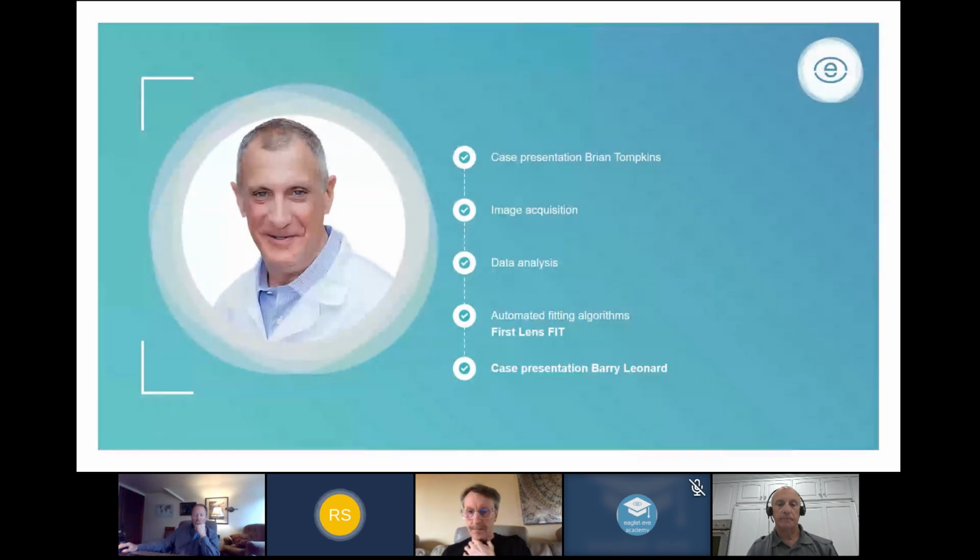There was one more question. Paul Kuzi asks, does it recommend the best overall diameter? No, it does not. You can do this based on the HVID, and that's most often used, but there are some exceptions where you do not want to follow this rule.